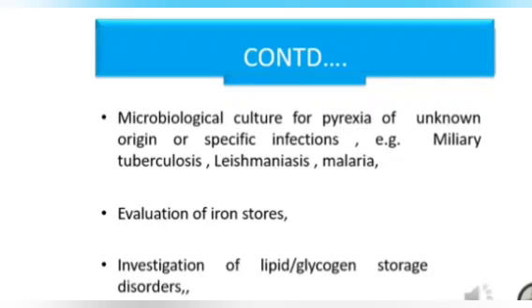It's very helpful in the diagnosis of unexplained causes or unknown etiology. That may be anemia, that might be leukemia, or that might be microbiological, or that may be parasites. So this is an important and very helpful diagnostic tool in the field of hematopathology.